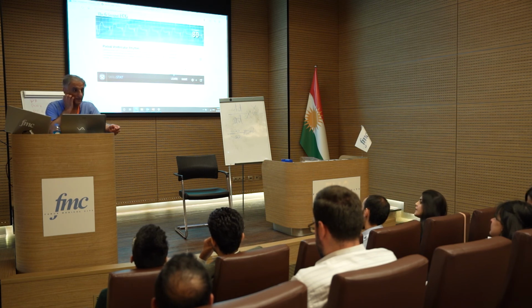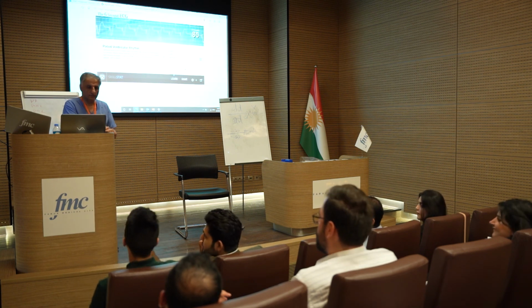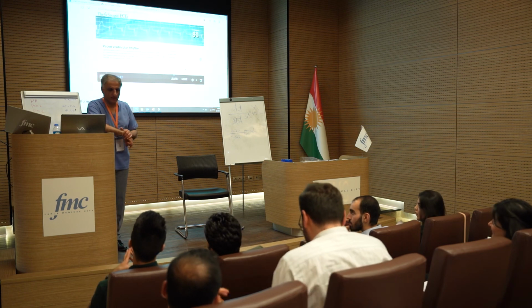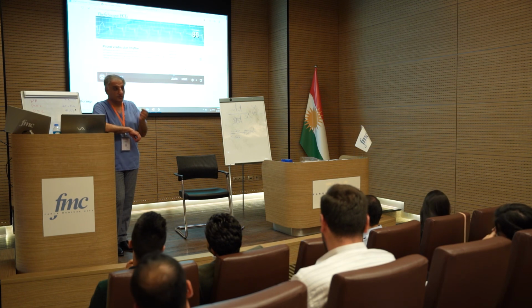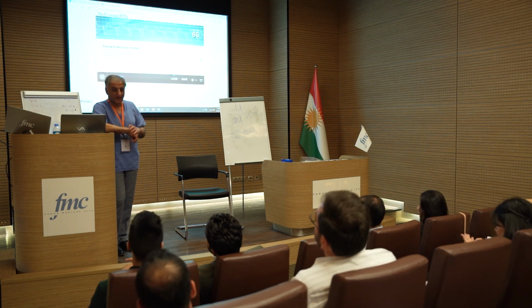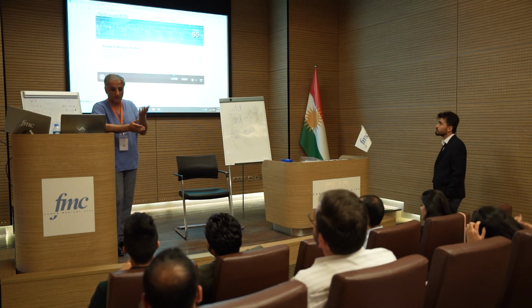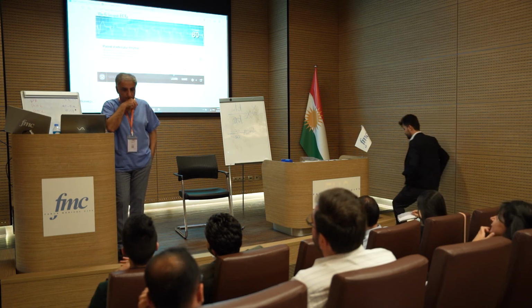Right. Any questions about blood gas? Do we need to do the anion gap every time we have acidosis? It's better. But the limiting factor is that we don't have chloride in the machine, and we have to send it to the lab, which sometimes takes time. Chloride seems more difficult to measure than potassium and sodium. So if we can interpret without the anion gap, it's okay. But if we can't, we send for the chloride and calculate.